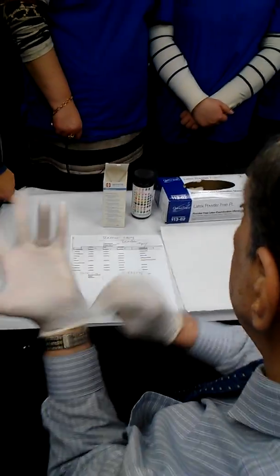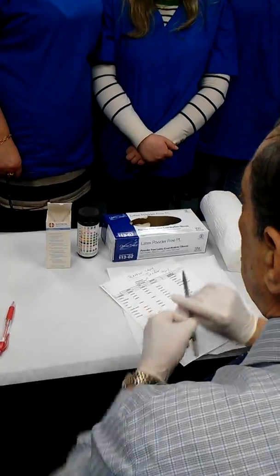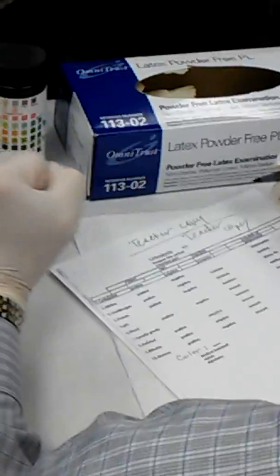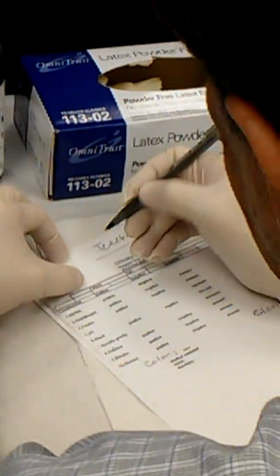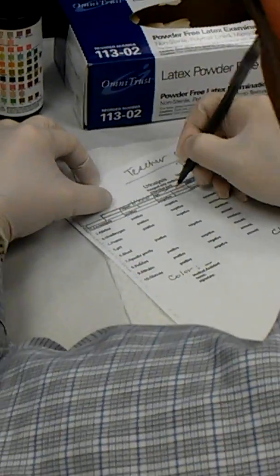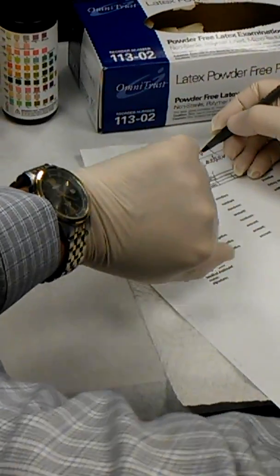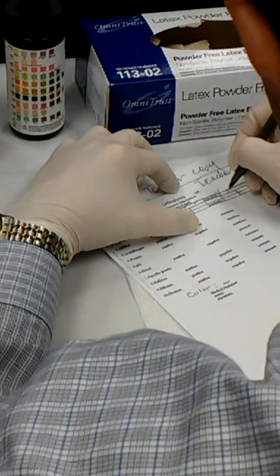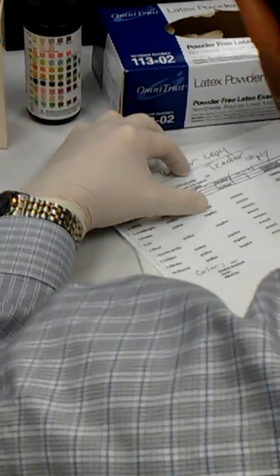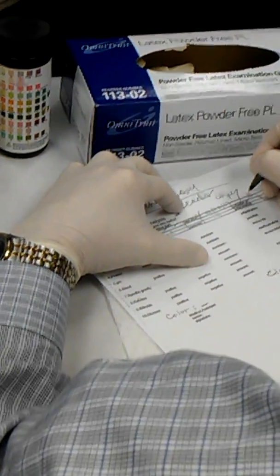Okay, guys. So you have this paper. It's a paper for a practical thing, right? So you have to write the patient name, Ray Nikolai, age, date of birth, and date and time for today. Today is February 28th, 17, and time is 18:20.